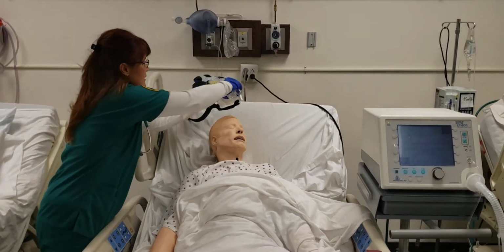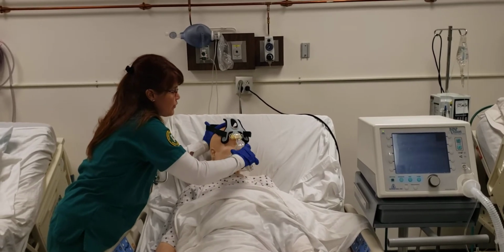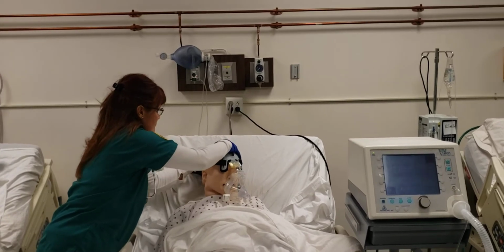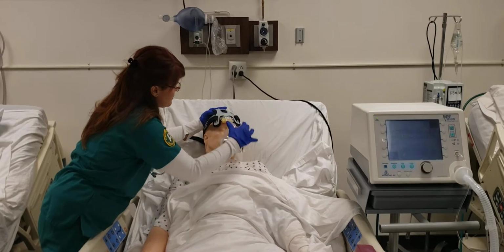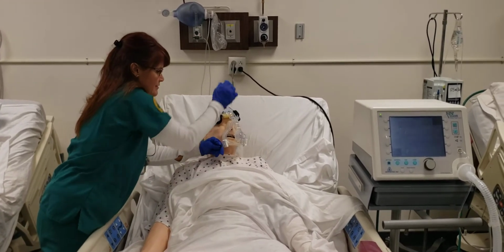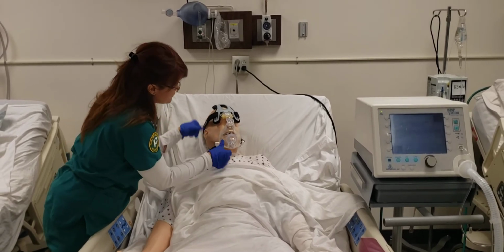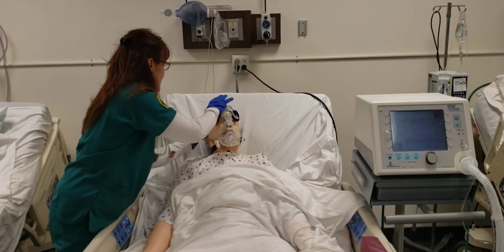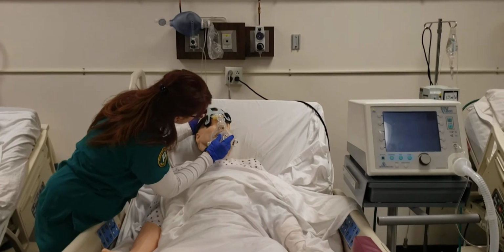All right, bear with me here. We're going to put this over your face. Mind you, there is flow going to it for patient safety. We want the mask to be tight, but not too tight to where it's uncomfortable, but we need to watch the leak. All right, so how does that feel? All right, just a little bit more time here. Okay, it's looking pretty good.